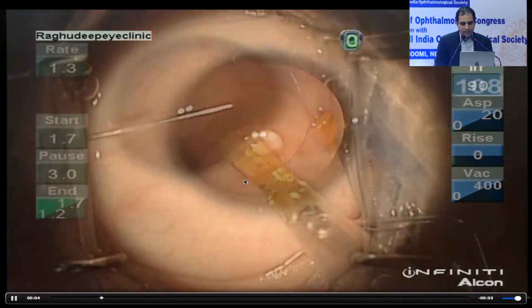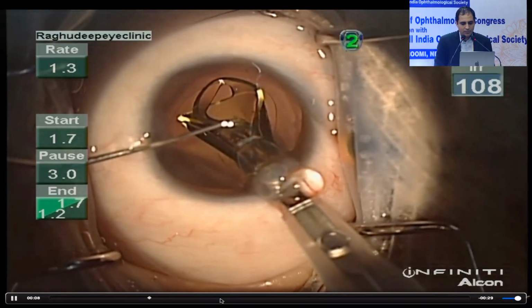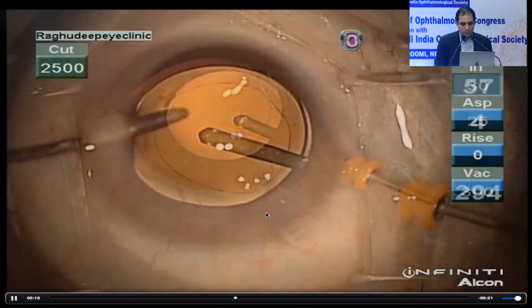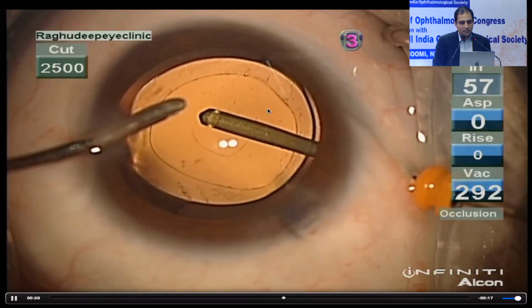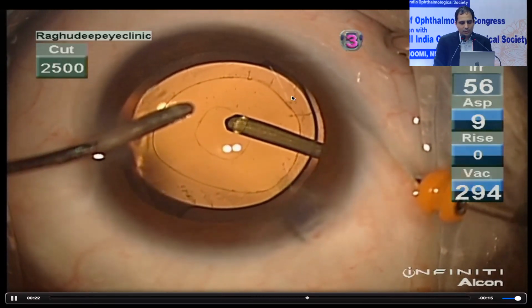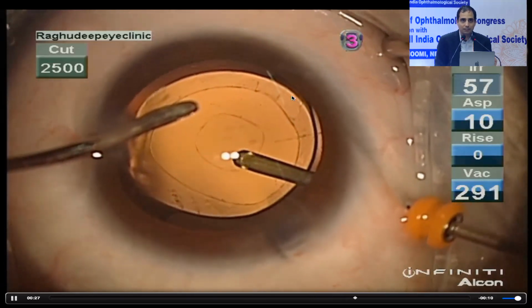This is what we have ended up with. Now we place the IOL in the bag, and then we suture the main wound, make a trocar, and along with the vitrector, with very controlled action, because vitrector ports can split very quickly.